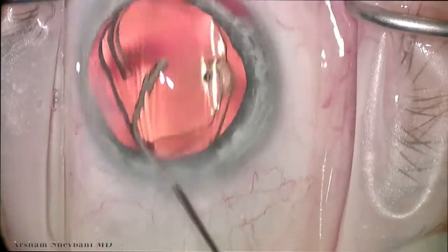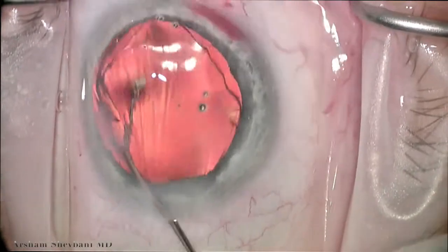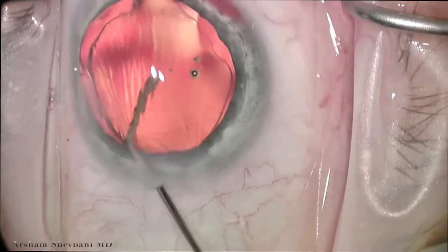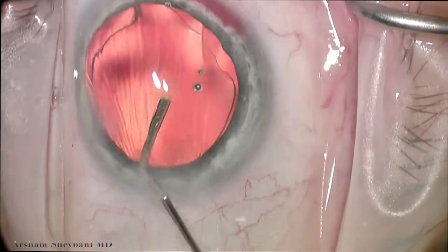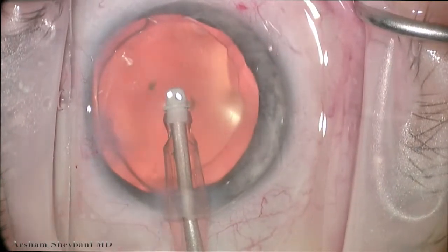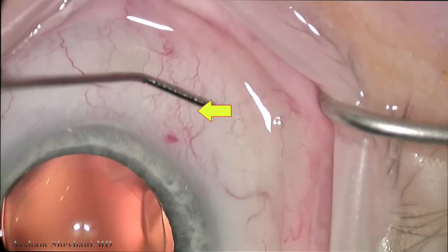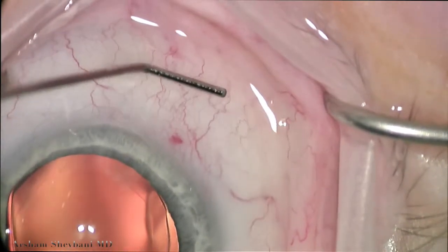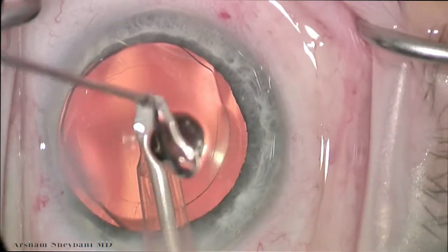And once it's well seated, again, if you look superiorly, you start to see the reflux of blood coming through that area where we inserted the eye stent. It's important that we note this reflux of blood — this is the area that we targeted. We remove the blood and the viscoelastic from the anterior chamber. And if you look just under the cannula, you'll see a dart of fluid going through that channel, that collector channel where we placed the eye stent.